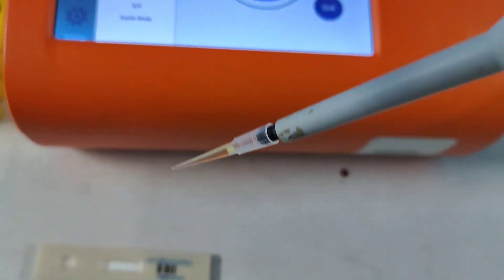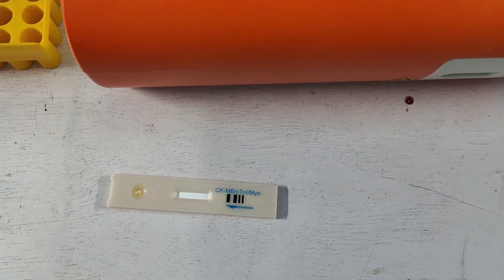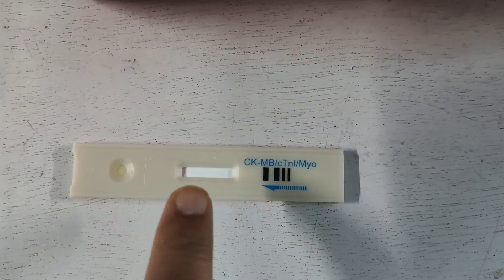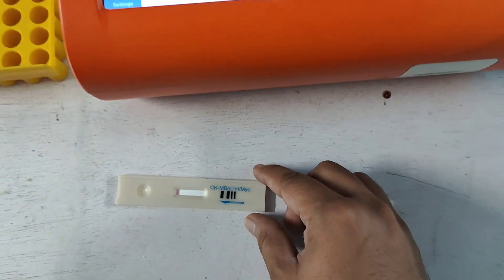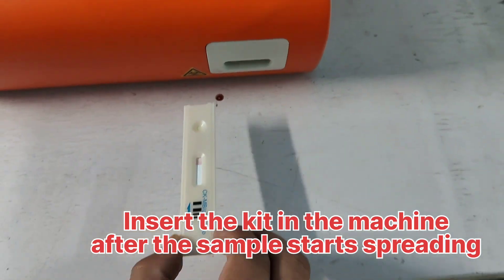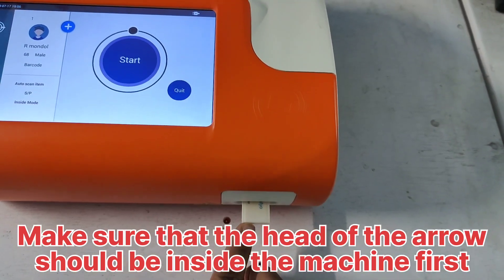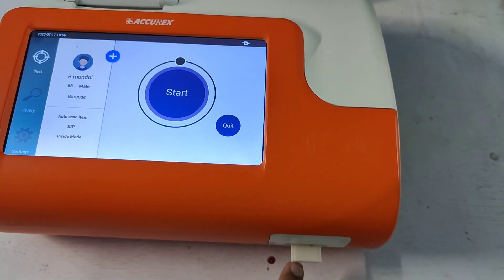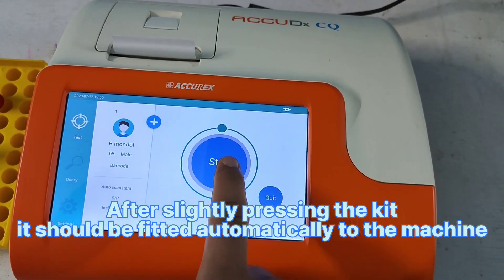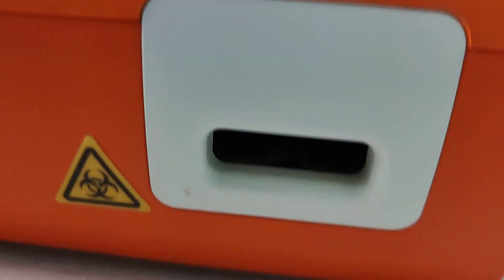100 microlitres — I am going to charge this place. Look at this, the sample is spreading. Now I am going to insert it at the kit loading site. The arrow points this way, so I am going to insert it in this direction — press and slide in a little bit. Now you have to start the machine by touching this. As you can see, the kit is inserted in the machine.